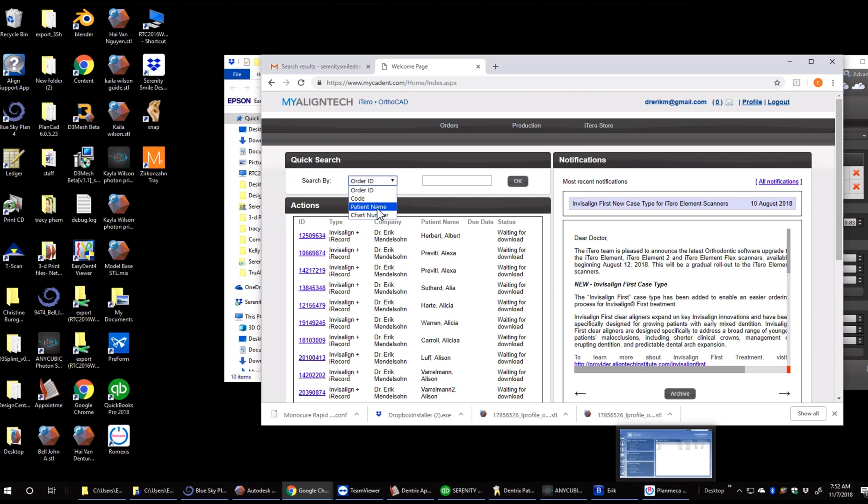So first we're going to do patient search by patient name. We would type in the name if we needed to here. I'm just going to pick the first one.